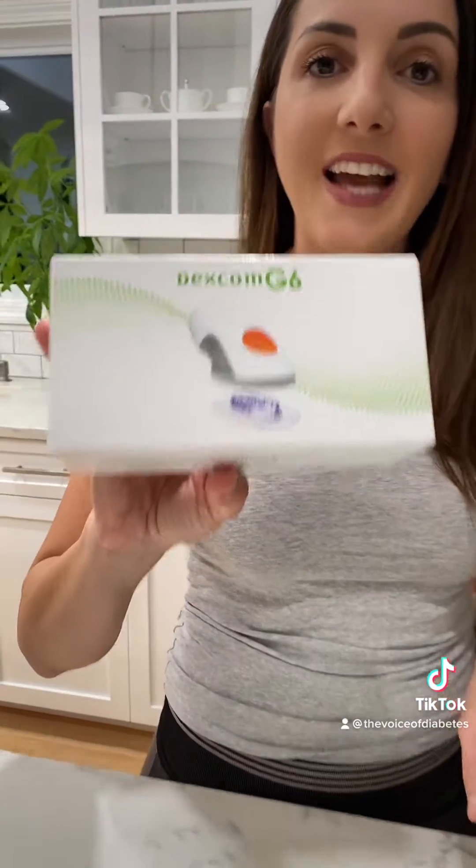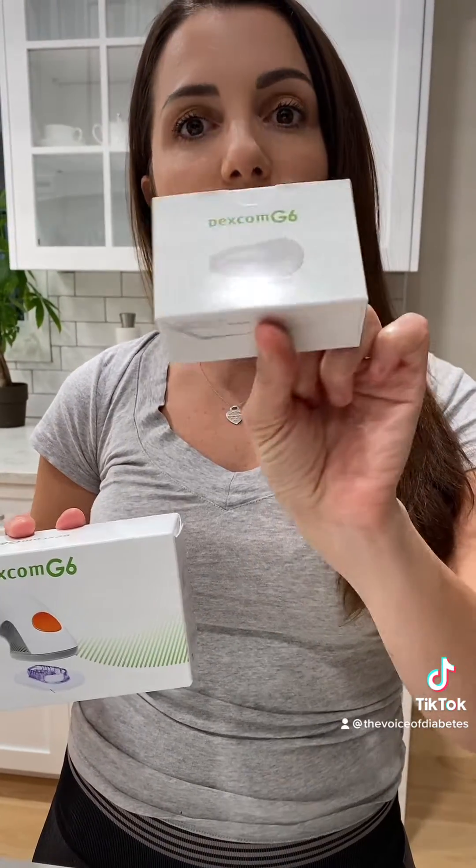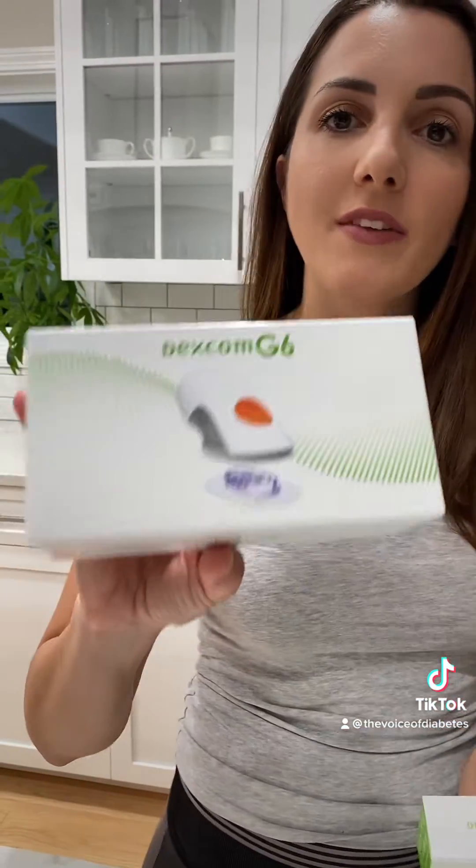So it's pretty cool, let's get started and see what we have in here. We have our sensor kit, which is good for 10 days only, and then we have our transmitter which is going to be good for three months. So you need one transmitter every three months and one sensor kit every 10 days.